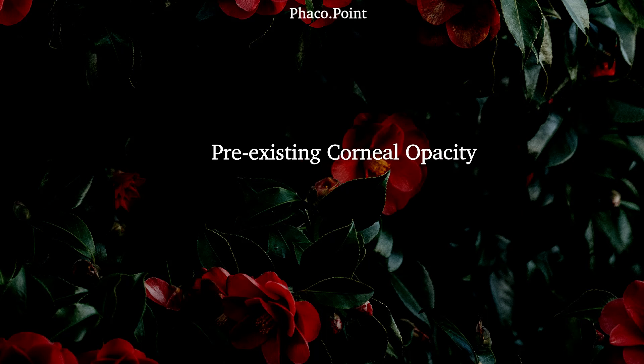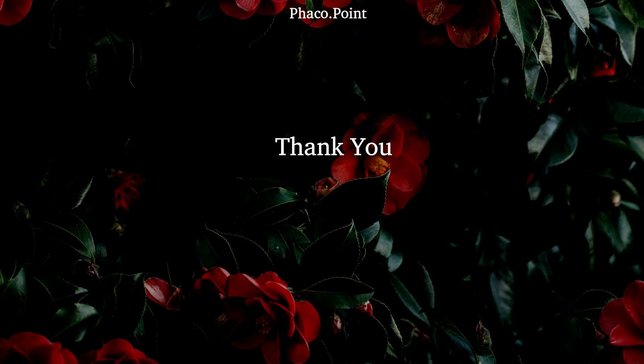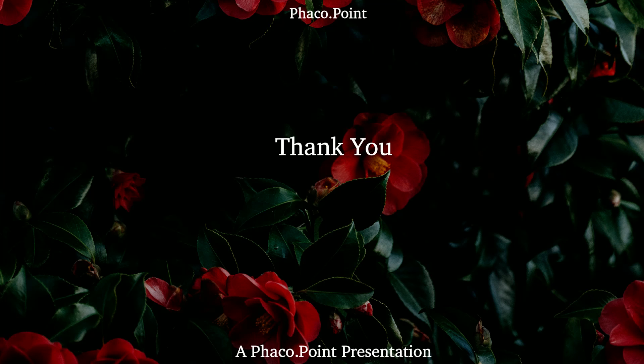The final case I'd like to show is one where there is a peripheral corneal opacity. When we make incisions through corneal scars, remember that the tissue there is distorted and the feel as we traverse the scar tissue may be very different — therefore make these tunnels extremely slowly and cautiously, paying attention to the feel as the blade goes through that tissue. This brings us to the end of the video tutorial on perfecting the art of mastering the clear corneal tunnel. I do hope that some of you found this useful. Thank you.